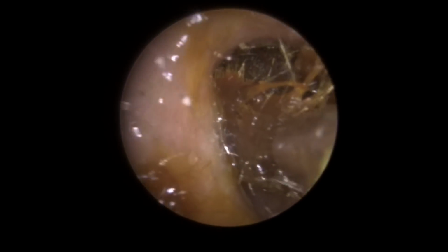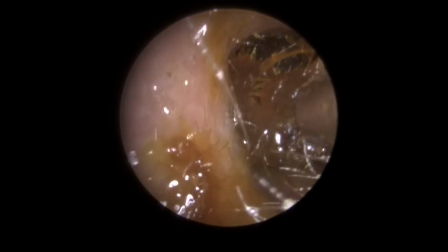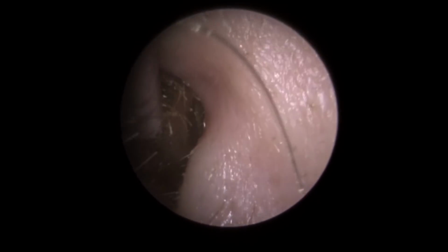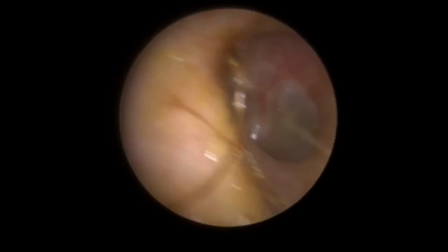Because of the shape of this wax, you'd find with a Jobson, because you hit that sort of wider section at the top of the wax, you would end up pushing it a little bit further in. So that's why I've stuck with the suction tube for this particular one. We have lots of people asking us, we use some tools a lot more often than we use others. So yeah, we do tend to use suction quite a bit. I find that usually the most effective way of removing the wax.